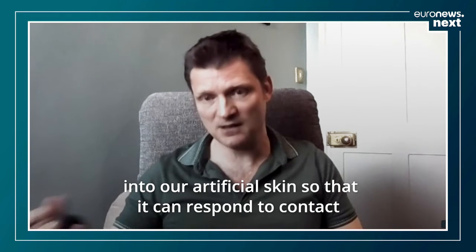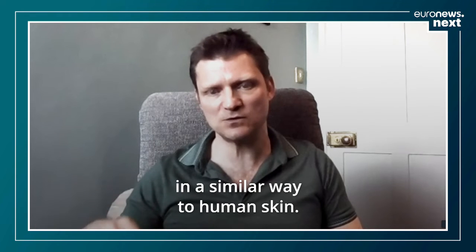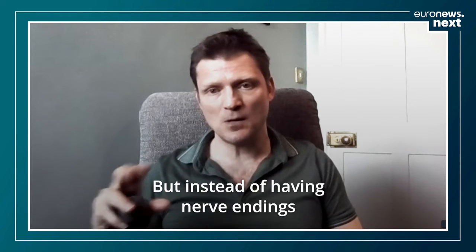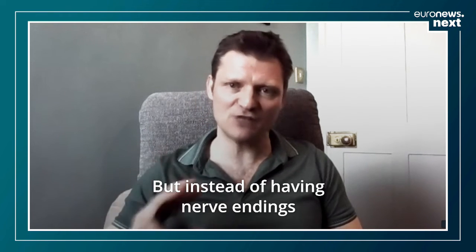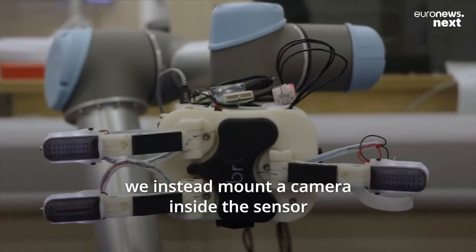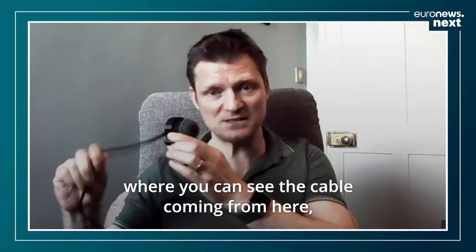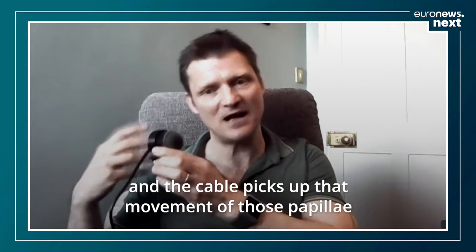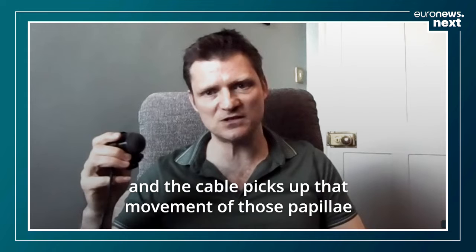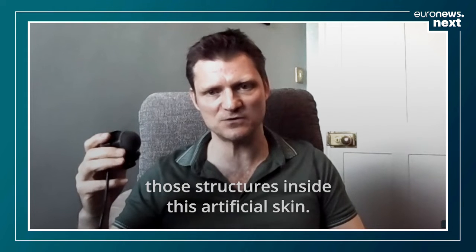The artificial skin can respond to contact in a similar way to human skin, but instead of having nerve endings found in real skin, we mount a camera inside the sensor. You can see the cable coming from here — the cable picks up the movement of those papillae, those structures inside this artificial skin.